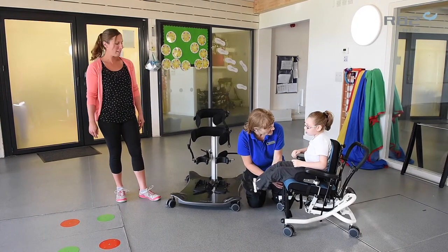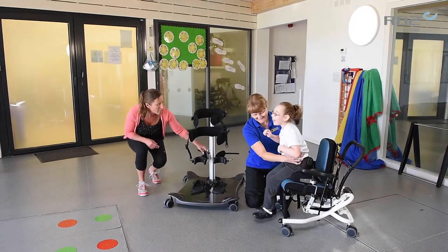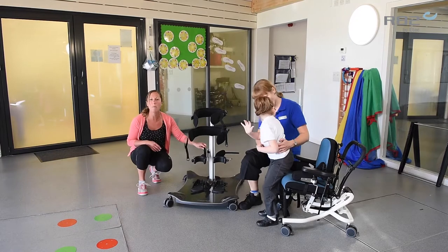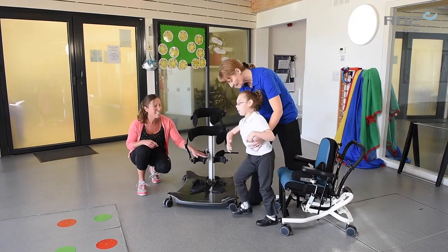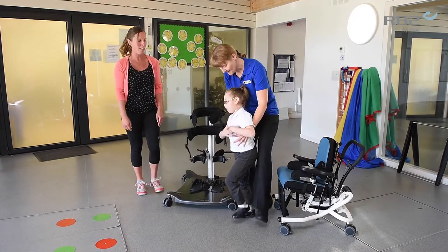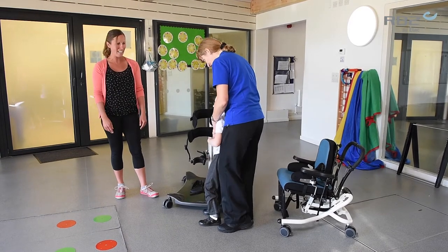I'm going to come out of the bomber and I'm going to facilitate the step into the Meerkat. With the knee support, they're really easy to flip away so you can have them back out of the way to help this transfer nice and simple. So these can be set up ready before the transfer. And you can see Michaela using those nice facilitation techniques to step Poppy into the standard.